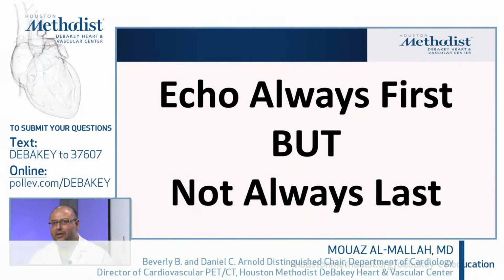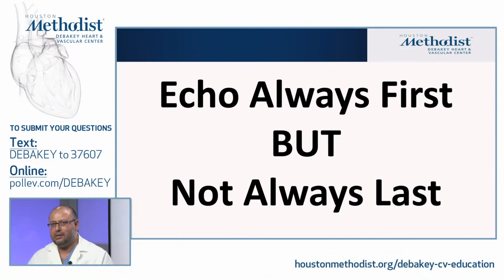All right. Thanks, Steve, and this was a wonderful review of the role of echo in endocarditis. Now I'm going to try to put on my multi-modality hat and cover CT, CMR, and PET in endocarditis. So as Steve just showed us, echo is always the first tool that you're going to use in assessment of these patients. However, there are many instances where you need to acquire additional information, and this is where these adjunctive modalities come into help.